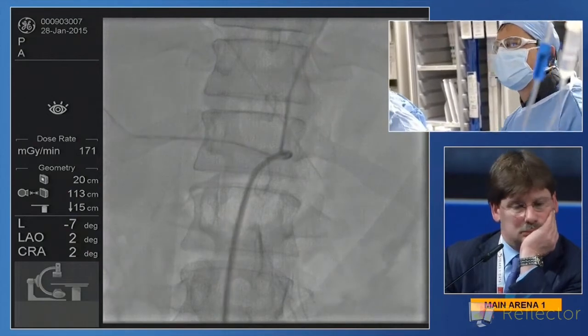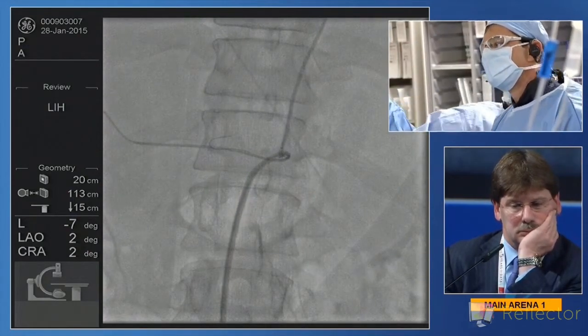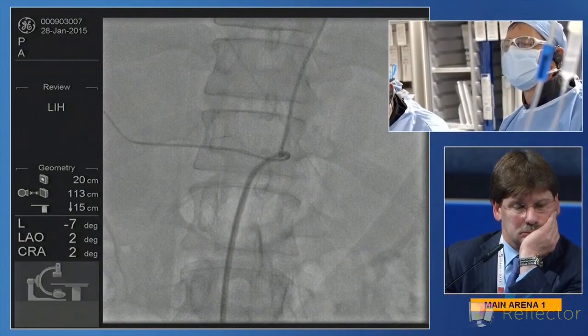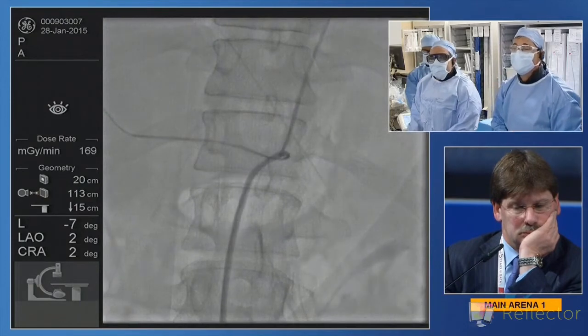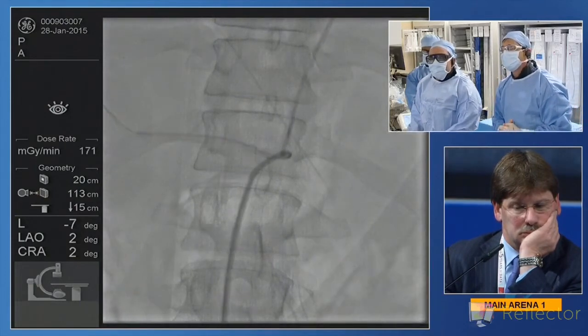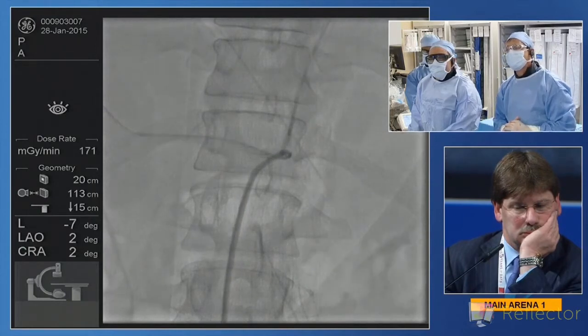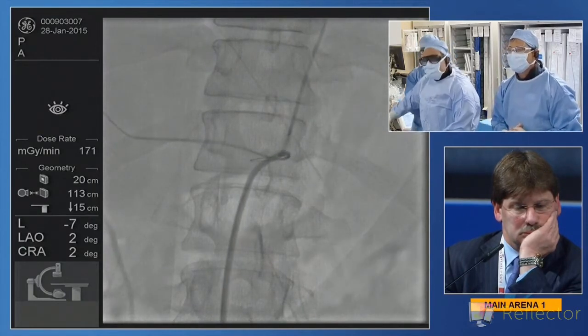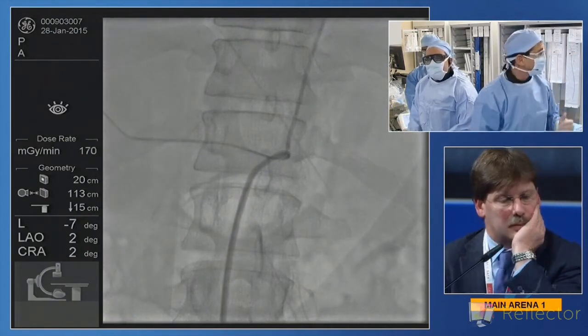Now, there is a little left gastric there that we see. We're sort of going to keep an eye on that. I'm not going to coil that right now. If need be, we can always come via right gastric. We do that fairly commonly in the setting of some of our cancer interventions, so we're comfortable with it. But I don't think at this setting we're going to necessarily treat that left gastric. Again, we're not so much worried about the size of the aneurysm. We're worried more about embolic risk and progressive dissection in this particular instance. Let's get a Platinum Plus, please.